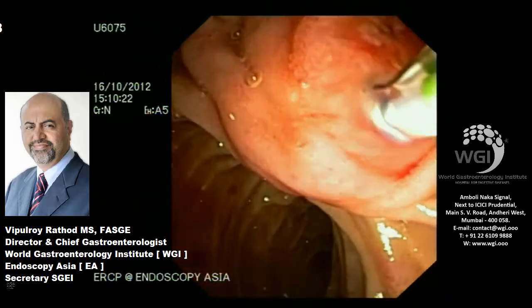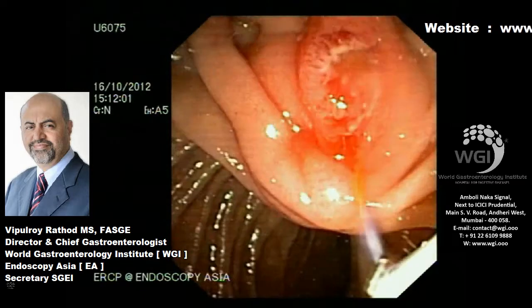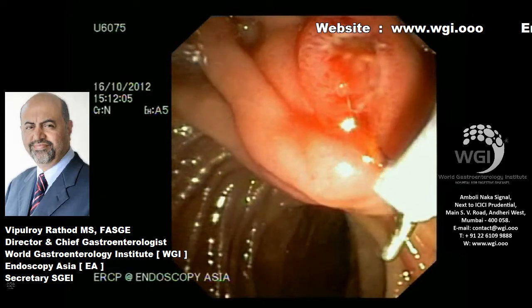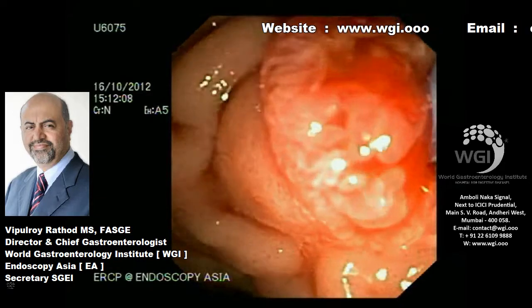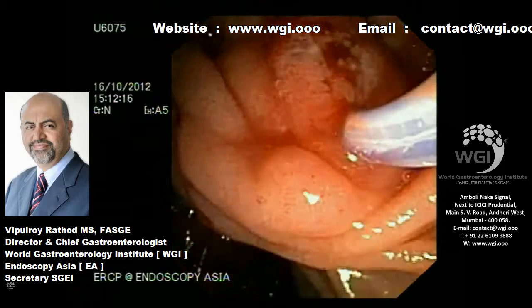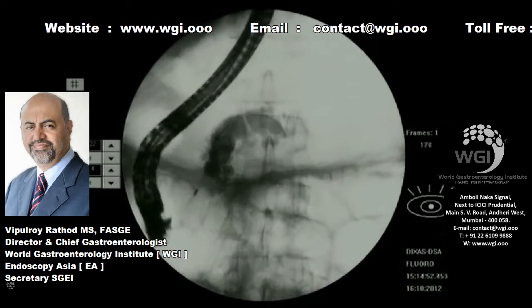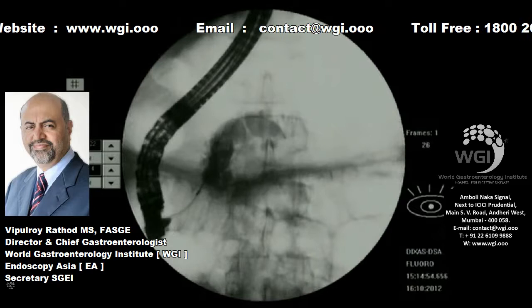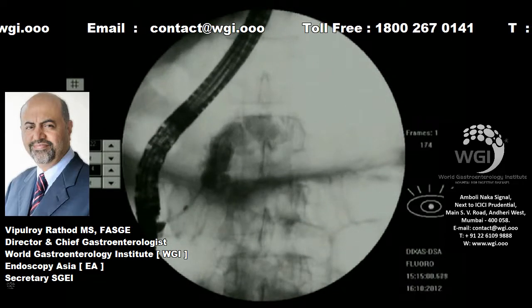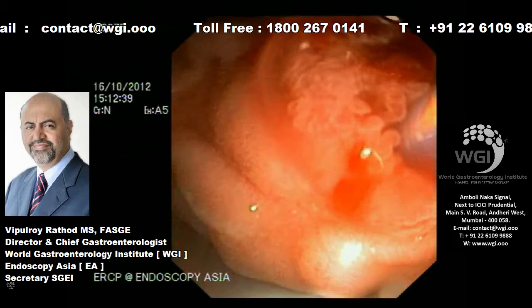We aspirated the pancreatic juice and took brushing and cytology, so we are taking the brush cytology now from the pancreatic head stricture here to make sure that we definitely rule out as far as possible any obvious underlying neoplasm. So you can see it's extremely tight stricture with dominant narrowing in the head of the pancreas with dilated pancreatic duct.